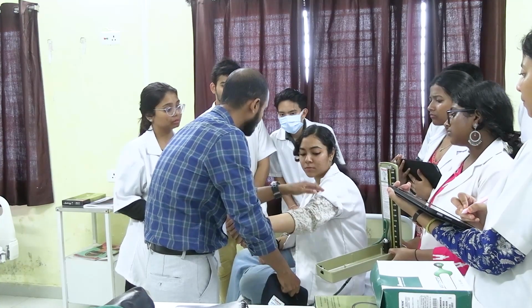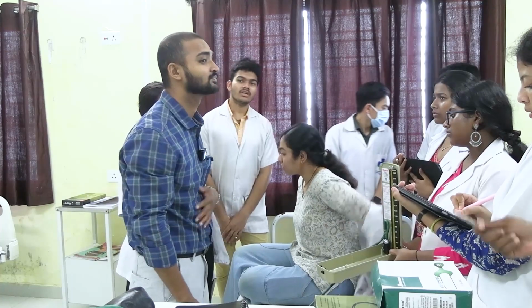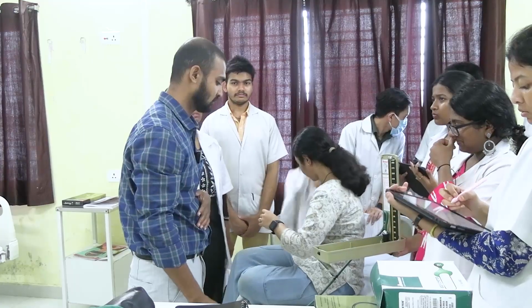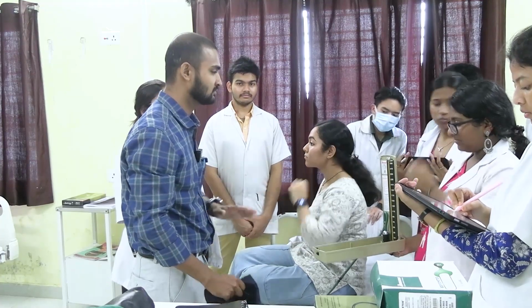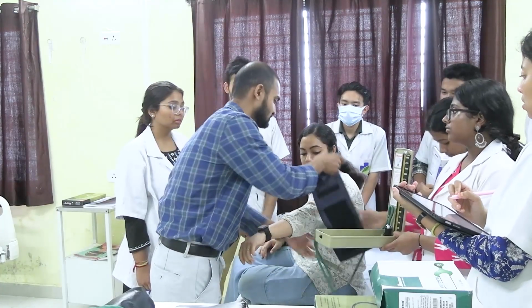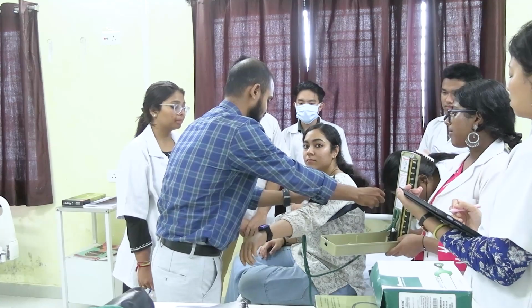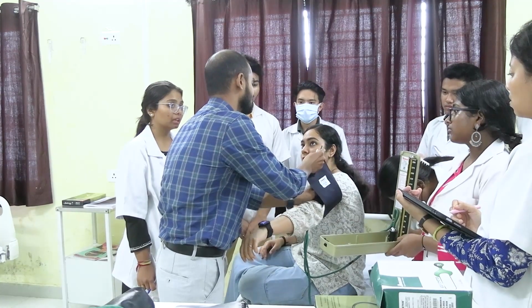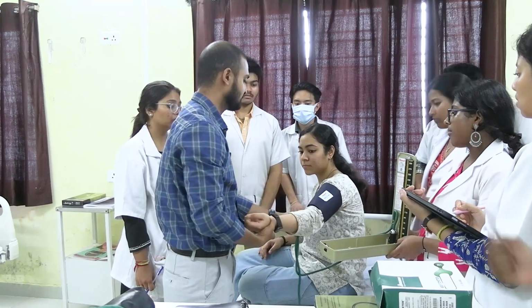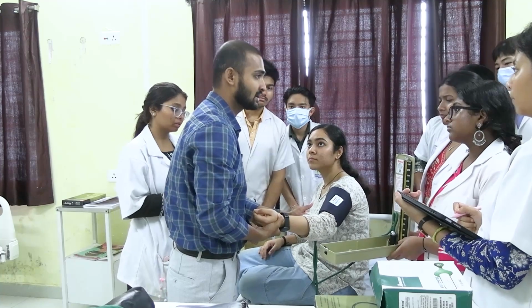Okay, can you open your apron? Above the elbow. The tube should be facing medially. Okay, you are telling about the tube, but where should the cuff be placed? We have told you, na, this is the palpation of the brachial artery.